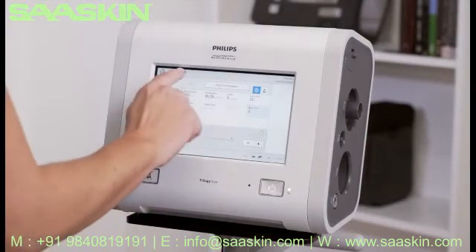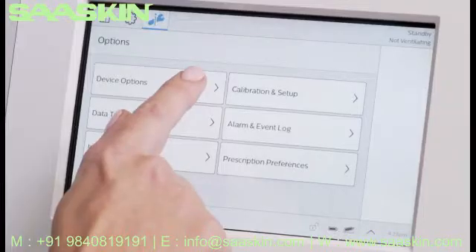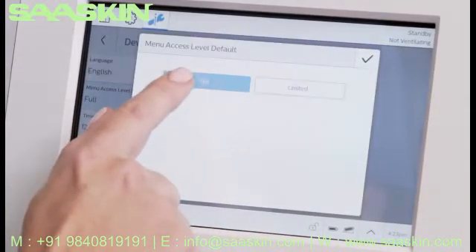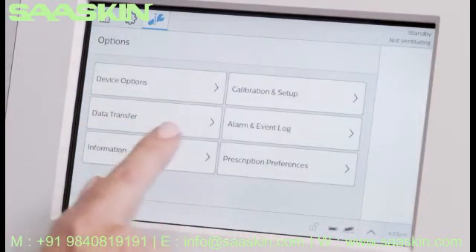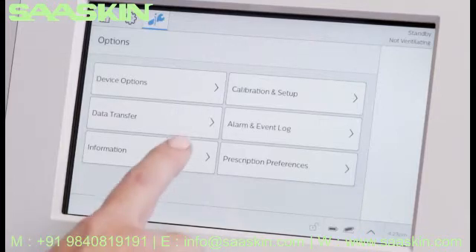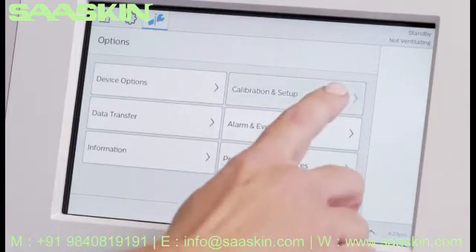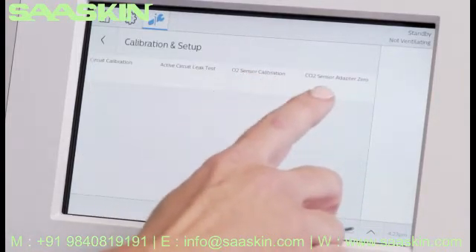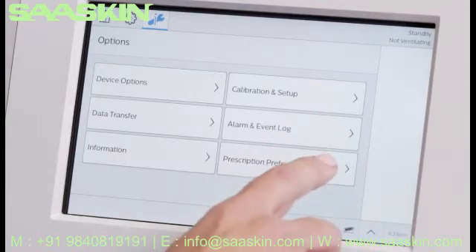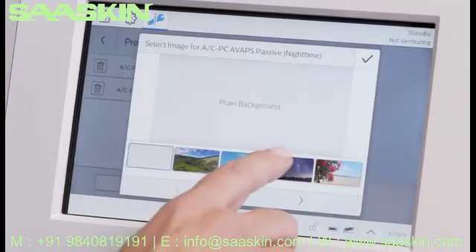Options, which contains Preferences and Other Choices, is next. You can change the menu access level between Full and Limited. Use Data Transfer for USB data downloads and software upgrades. Information provides device details such as current software. Calibration Setup contains O2 and CO2 sensor calibrations, among others. Below that option is Alarm and Event Log. In Prescription Preferences, you can delete or edit the prescription names and background images.